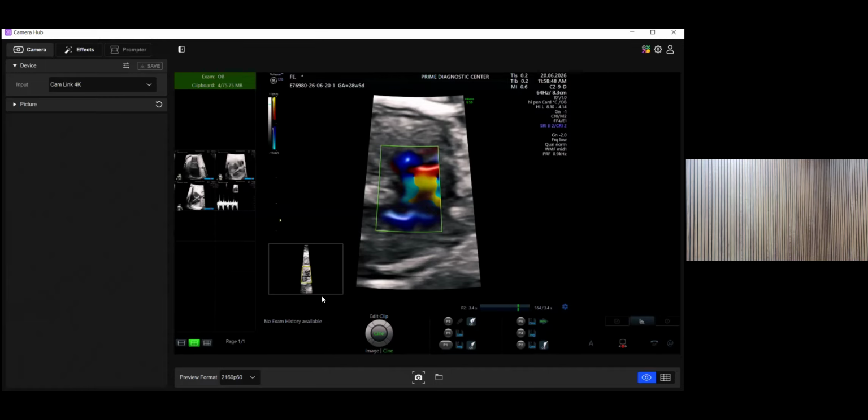Can you show the bicule? But we will do it. We'll do it. Certain areas I'm not very comfortable, I'll still do it. So this could be the first learning anyway. Yes, go ahead.